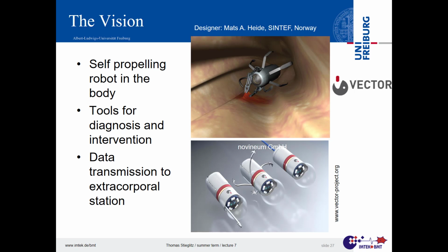If you would do that with a motor, you would need a lot of energy there, and therefore the approach was, can't we do that mechanically? So having a spring and a needle, and the spring is compressed. If you are on site, just send one electric impulse, click on a relay or something like that. The needle jumps out, penetrates the intestine wall, collects something, and then you need a second spring in the other direction, which draws that back and the lid flaps close. That didn't work.